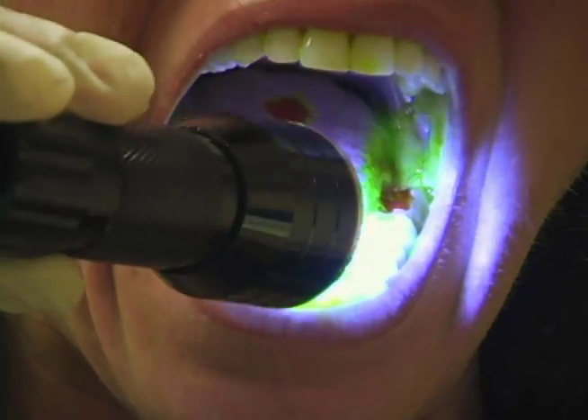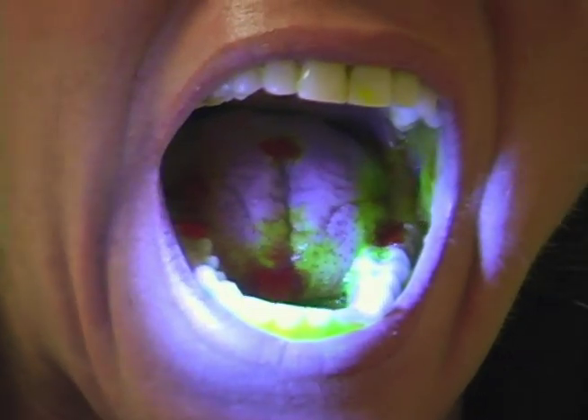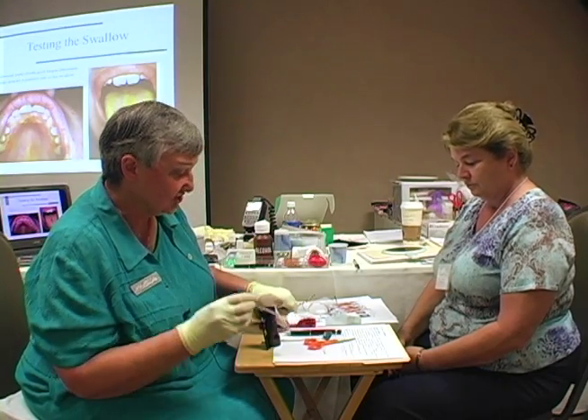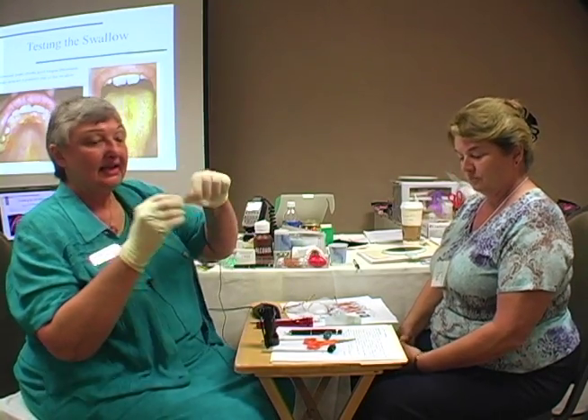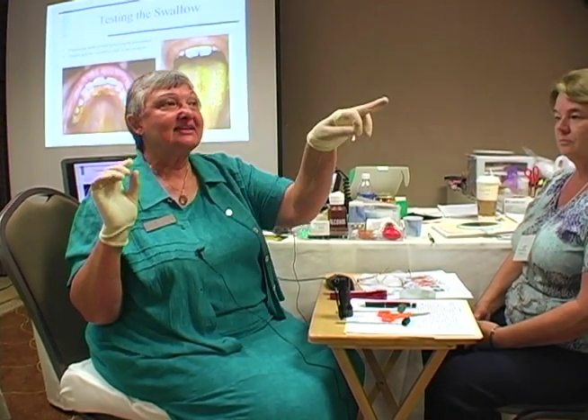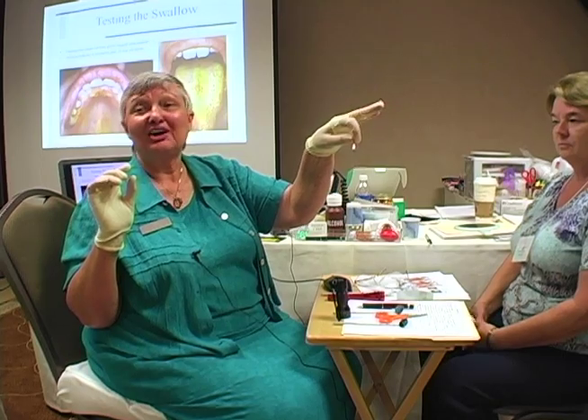See how that piece of paper is all the way across that molar? In this plaque check, what you're doing — this is really nice for the little kids especially, because the other dye tastes really bitter and pretty awful.